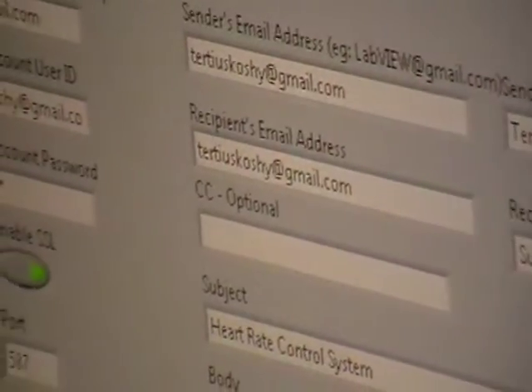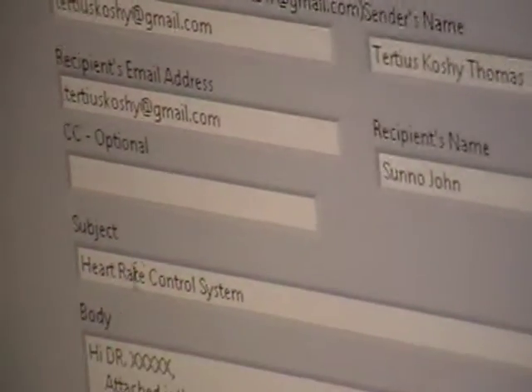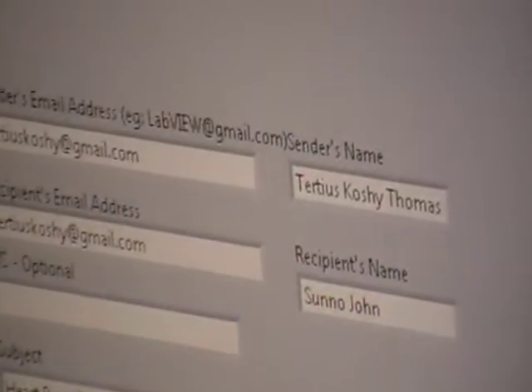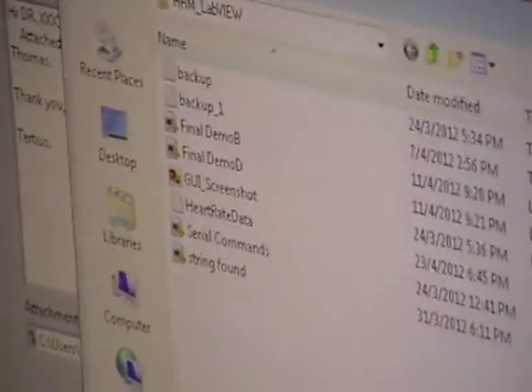So this is just for demo purposes. I'm giving the sender's email as mine, the recipient as mine also, and this is just a template message body. We can actually select which document or which data log file needs to be sent to the recipient. So I have chosen this heart rate data here.